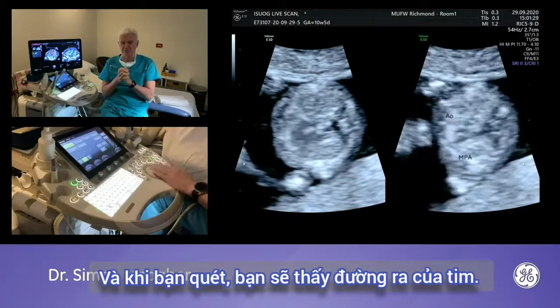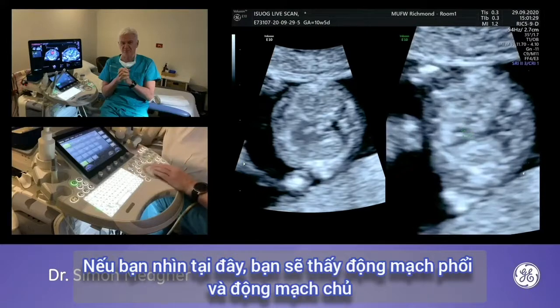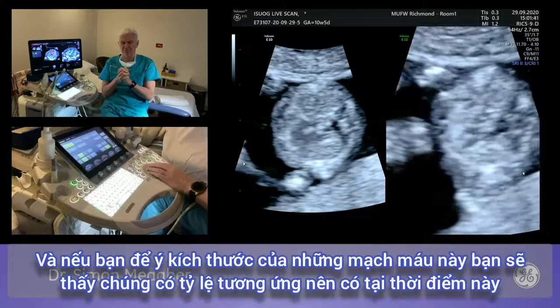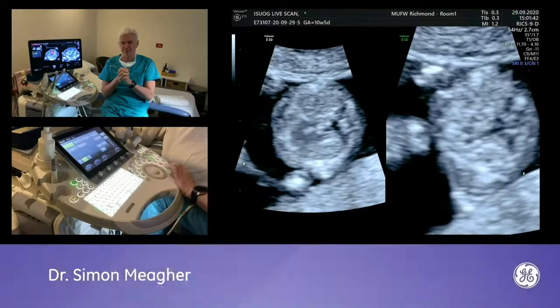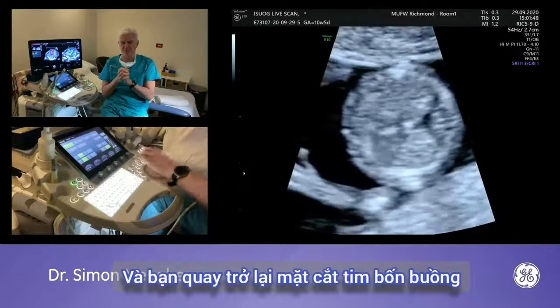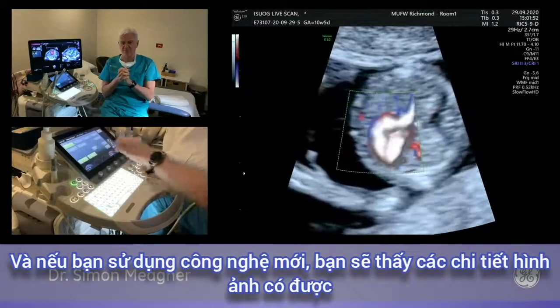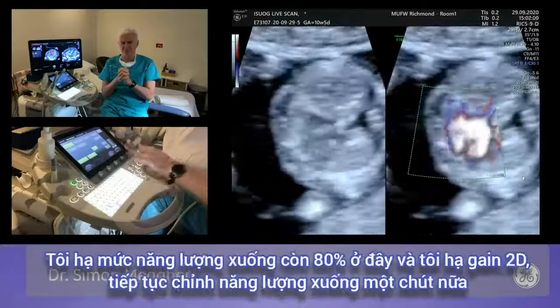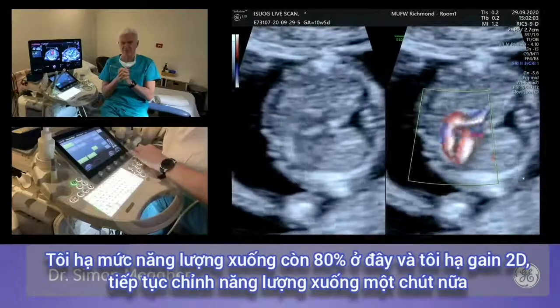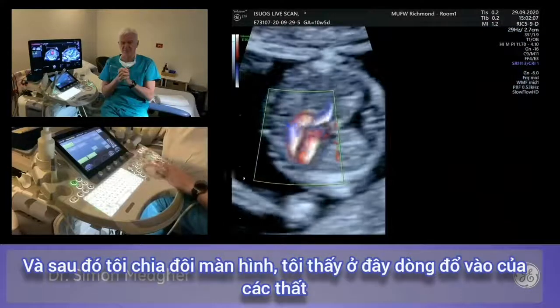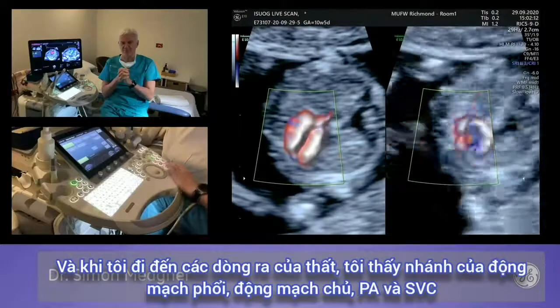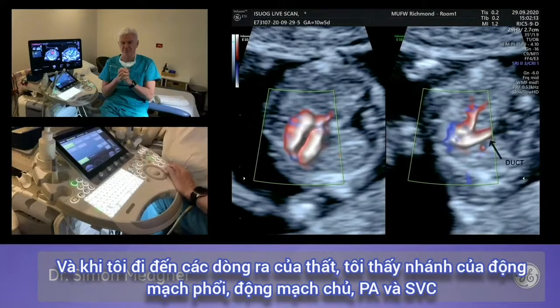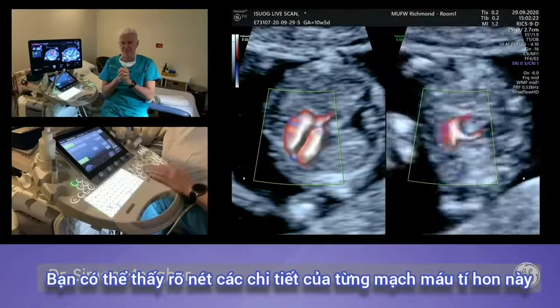Sweeping to get the outflow tracts: the pulmonary artery, the aorta, and the SVC — all in proportion to what they should be at this stage of pregnancy. Coming back to the four-chamber view and using newer technology settings — pulling back power to 80% and reducing 2D gain — a split screen shows the ventricular inflow and then the ventricular outflow. Branch pulmonary arteries, aorta, PA, and SVC are all clearly identifiable. Coming up higher you can also see the subclavian arteries.